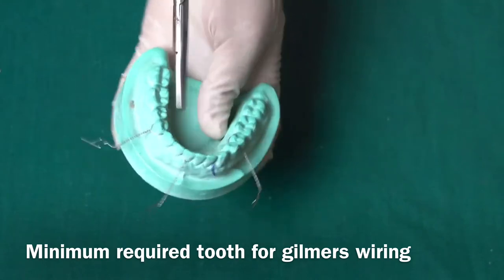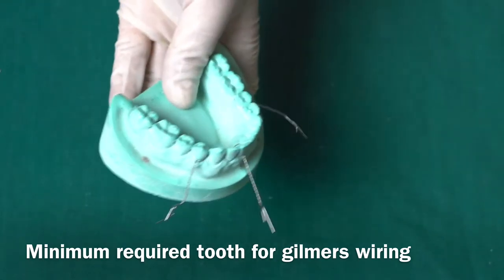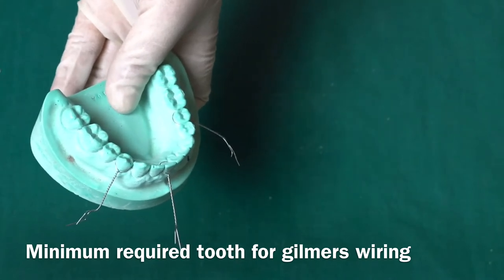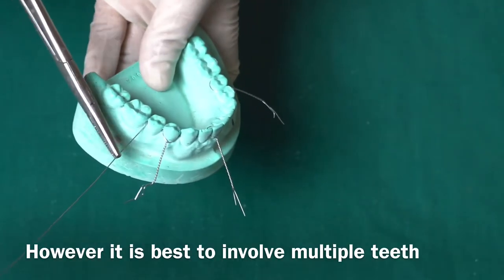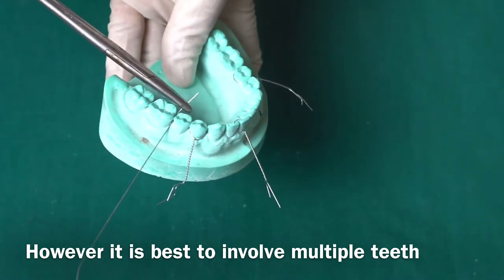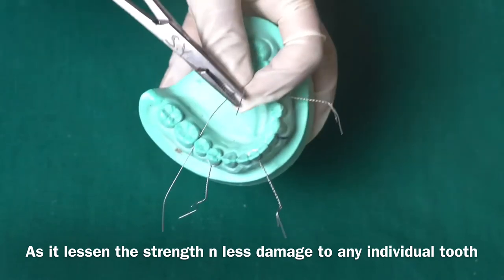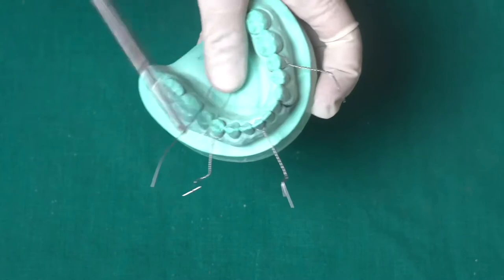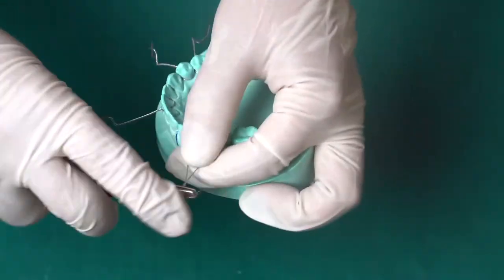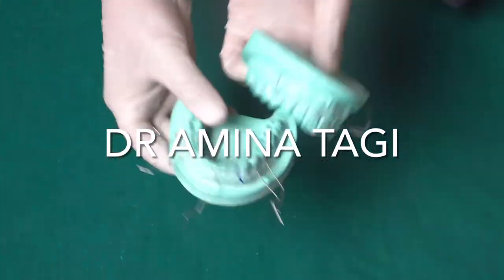These are the minimum required teeth selected for Gilmer's wiring. However, if you do wiring on multiple teeth, it will distribute the stress and cause less force on any particular tooth. Therefore, I am going to take another premolar tooth on the right side, and again on the left side another premolar tooth — so I will be taking at least five teeth in the mandibular arch.